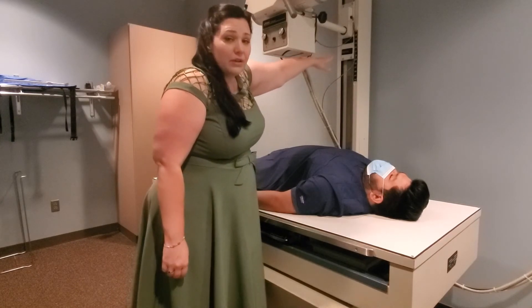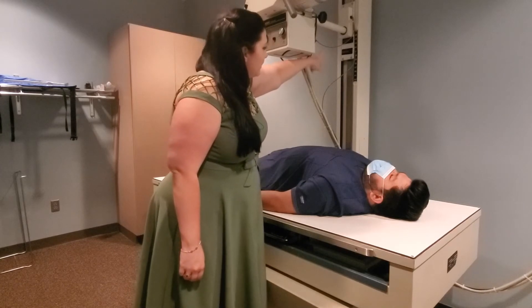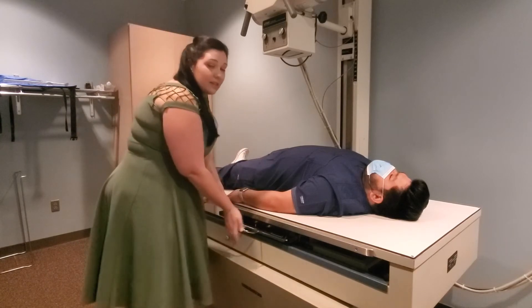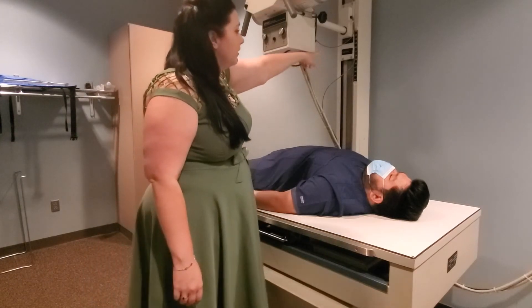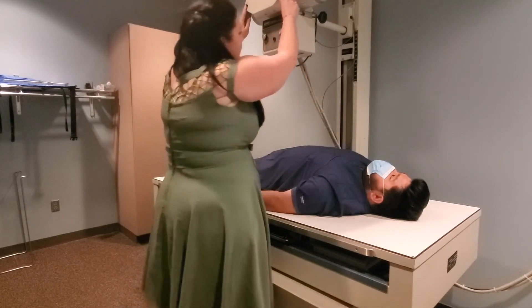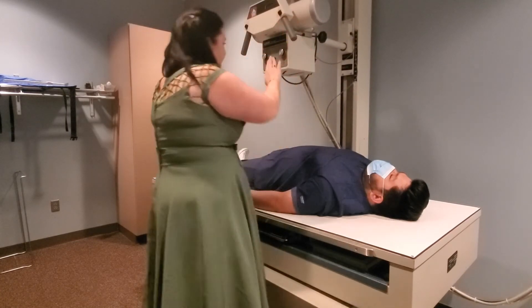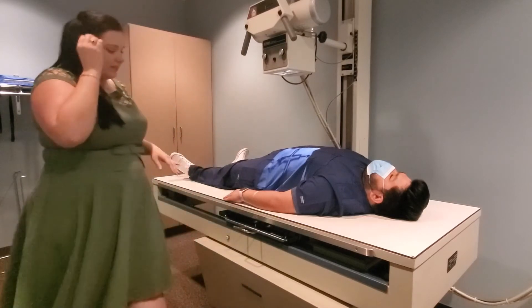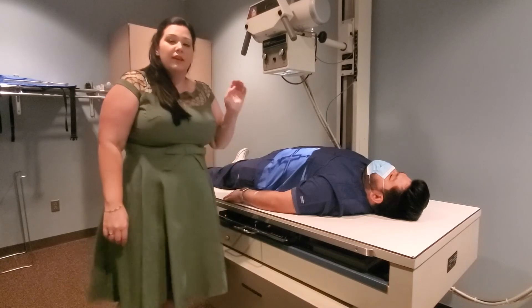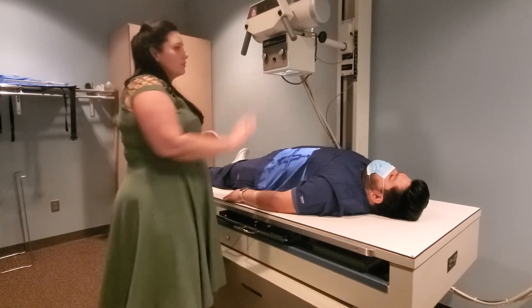Look at the measuring tape to find where you need to center. For this image the cassette is in the bucky, so go to the bucky instead of the tabletop for your 40-inch SID. Set up your 14 by 17, align your tube and cassette. The best practice with floating table tops is to move the table as much as possible rather than moving the tube and bucky.